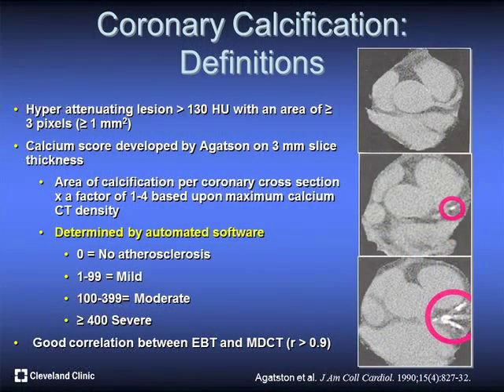One of the things that can be done is coronary calcification, where you do a non-contrast CT of the heart, where you look for specks of calcification, for which we define what is calcification and what is noise. And basically, you say whether there is calcification, and you grade it based on the Hounsfield unit criteria from mild, moderate, severe. And this works pretty good. These are 3 examples of somebody with intermediate likelihood of disease. The first picture, there is no calcium. Middle, there's mild calcium. And then the bottom one has severe calcification.